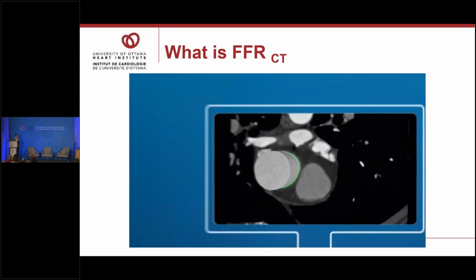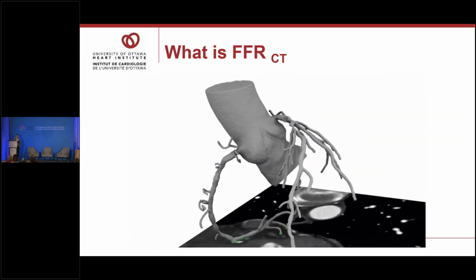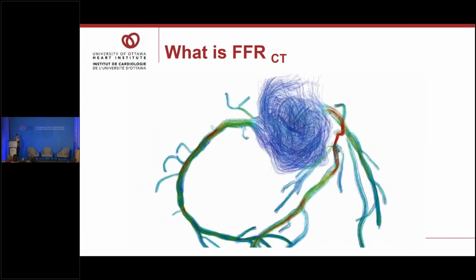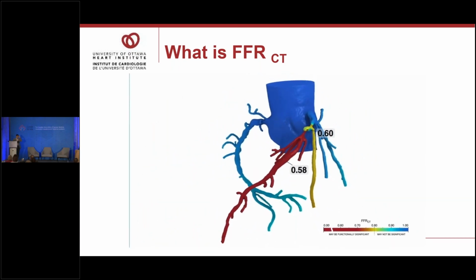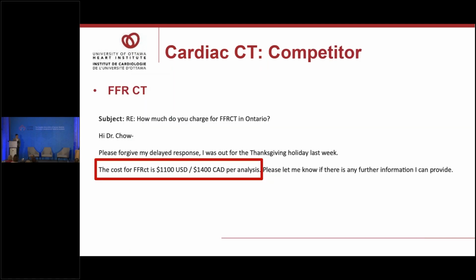Now, what has come down the pipeline is that red line that I demonstrated can actually be replicated with CT using fluid hemodynamic modeling. And this is a group, a vendor in the US that actually provides a service where you send them your CT data and they can potentially model and detect areas of ischemia. It hasn't been adopted in Canada, although it is Health Canada approved.